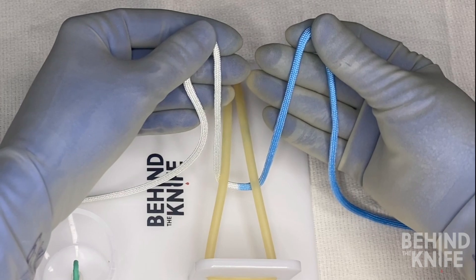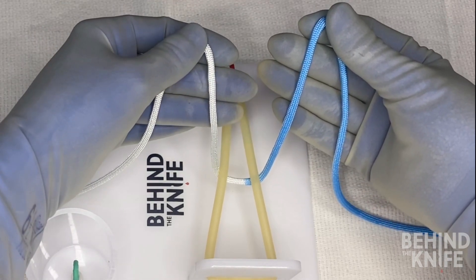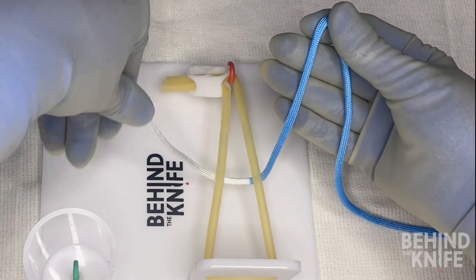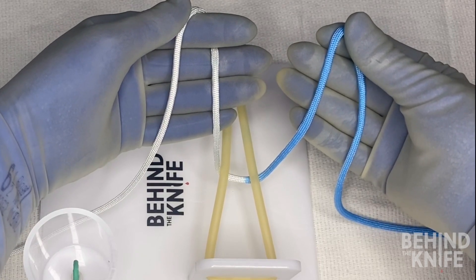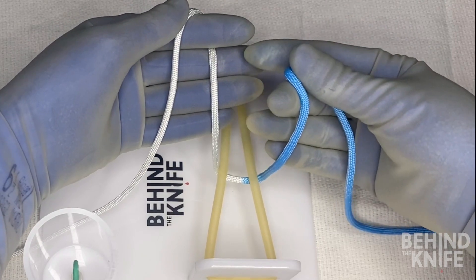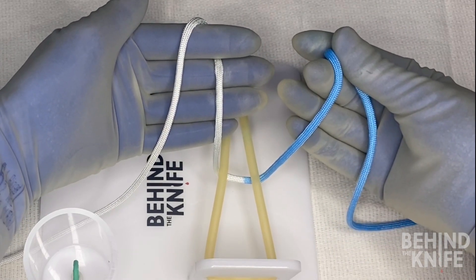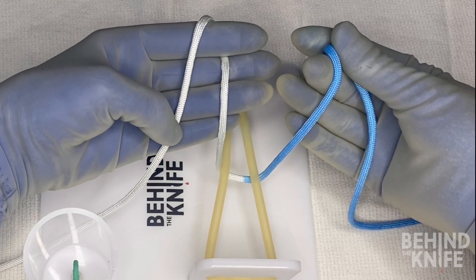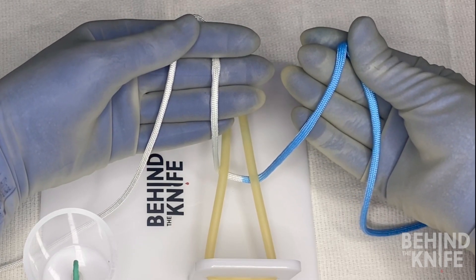The key to making this knot is going to be hooking your finger around the string, which can seem a bit confusing at first, so we'll start off slow. I'm going to drape the left side of my string around my left index finger so that the middle part of the string lays across these three fingers. It will drape over my index finger and the loose end will come up and over my index finger and drape across the palm of my hand like this.